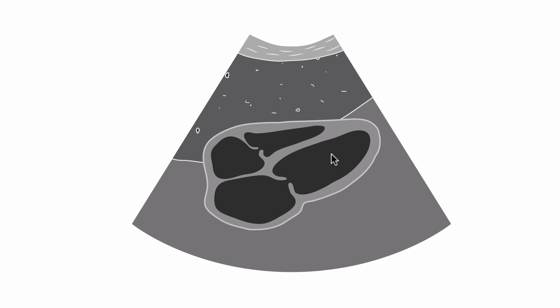Now we're going to think about the wall of the right ventricle and whether there's any hypertrophy. The best place to measure this is in the subcostal view, measured here very close to the tricuspid valve. We have to be very careful not to include fat in the measurement — we increasingly see a layer of fat around the right heart — so we need to make sure we're just measuring myocardium. This is normally 5 millimetres or less.